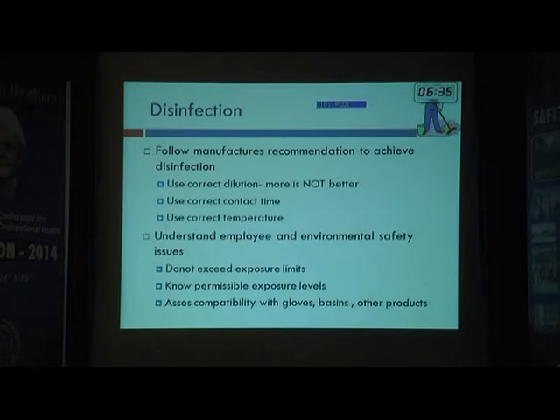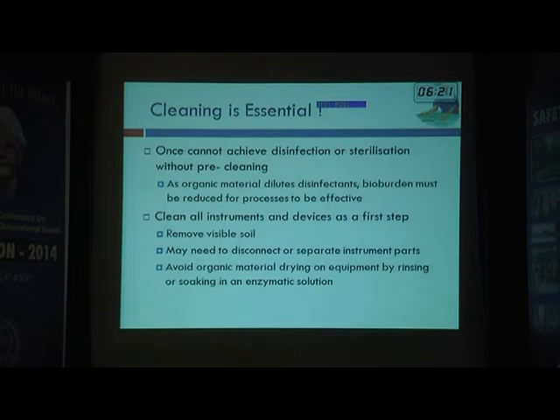And always use gloves and see the compatibility with gloves, basins. It should not be acids that can corrode through your instruments or through your gloves. So make sure that it is compatible before you use any disinfectant. And like I emphasized earlier, cleaning is very, very important. Remove all the blood, body fluids. Take as much as possible out. Wash with running water, or if you don't have it, soak it and clean it with a brush. Remove everything, because disinfectants cannot penetrate through soiled matter, whether it is blood or body fluids or feces or any other organic matter. It cannot penetrate. So please clean with good soap and water before you do any disinfection.